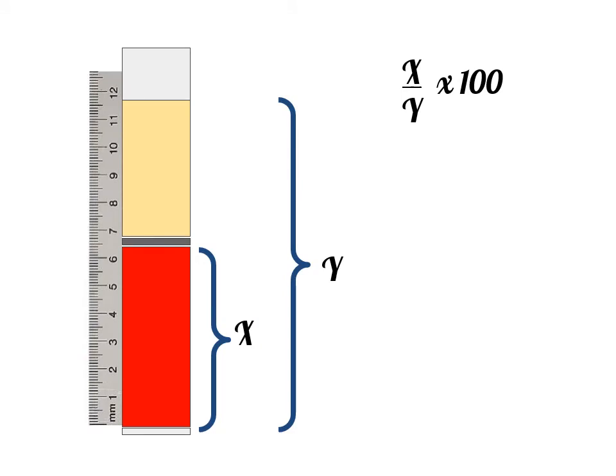There are two techniques for measuring hematocrit, and you must practice both. This particular method uses an old-fashioned metric ruler. Essentially, we will make two measurements and perform simple math. I've noted a generic formula for you here. Our first measurement, x, will be divided by the second measurement, y, and the result multiplied by 100. You can measure in either millimeters or centimeters, just be consistent.